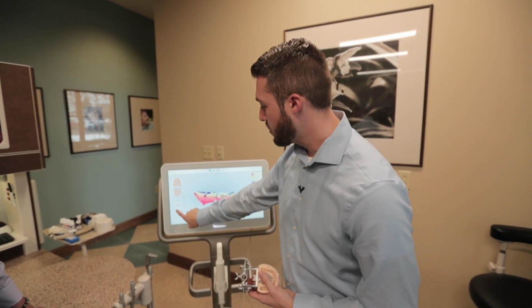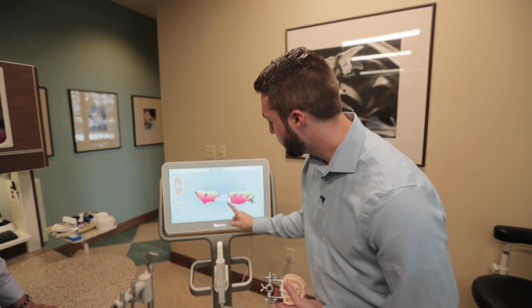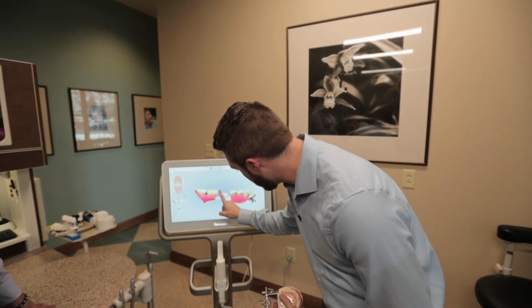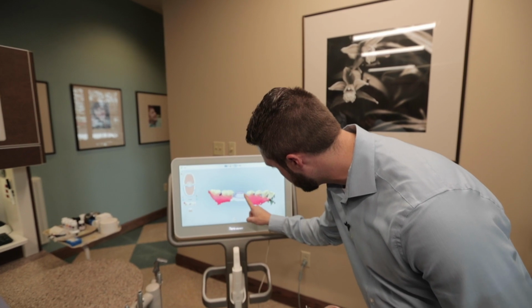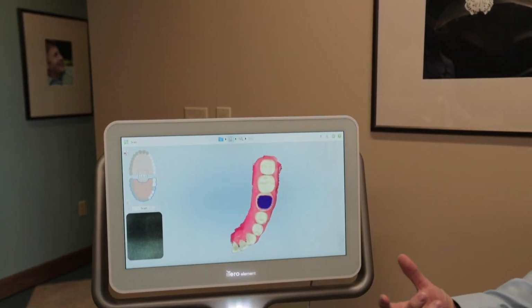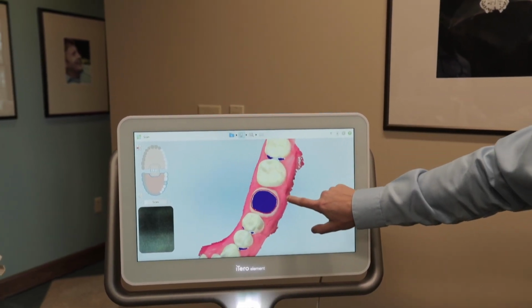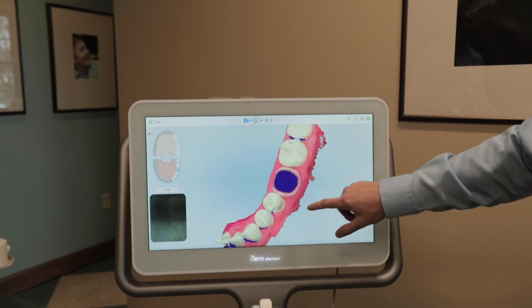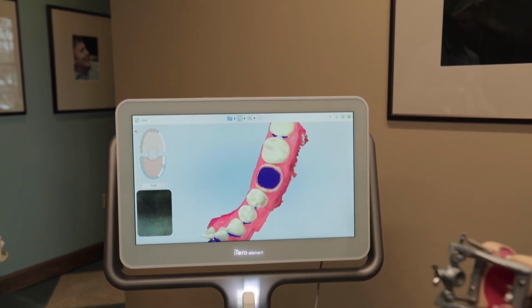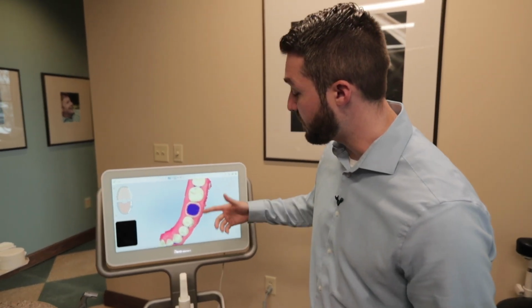So what we can do is single out the prep, right? We could then hit this eraser button, and we're going to draw a little halo right over this occlusal surface here. It's going to allow us, when we hit the scan button, to just scan in that new height. As you can see here, very quickly, I've done this a couple times, you can tell I've kind of gotten it down. I did not touch my margin line at all. Again, it's all about maintaining that margin, keeping it clean and keeping it clear of any contaminants.